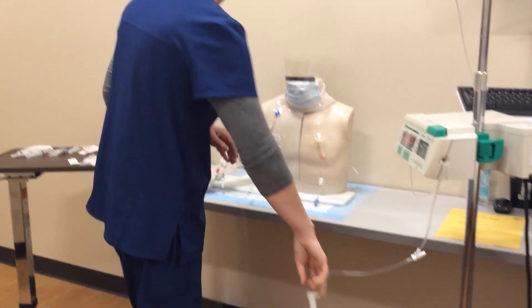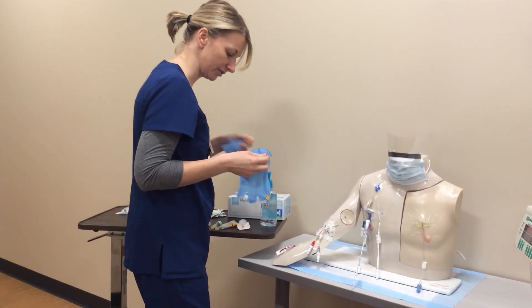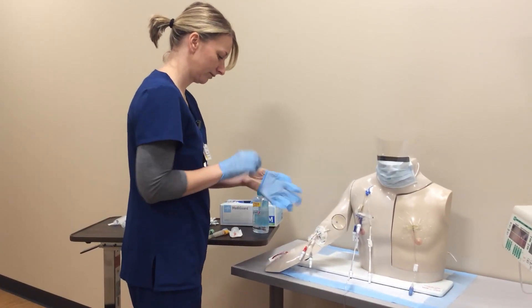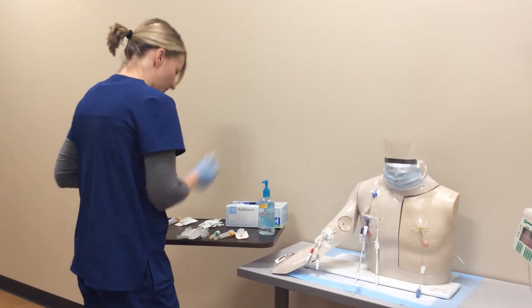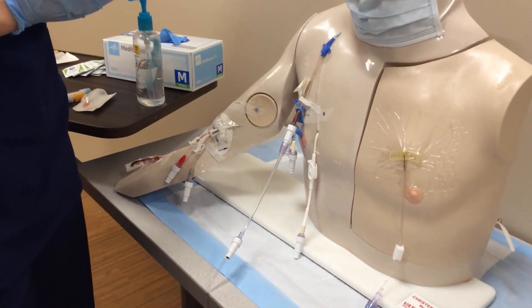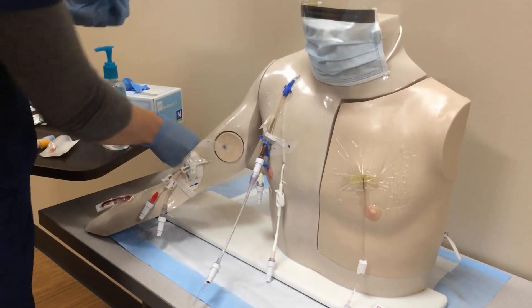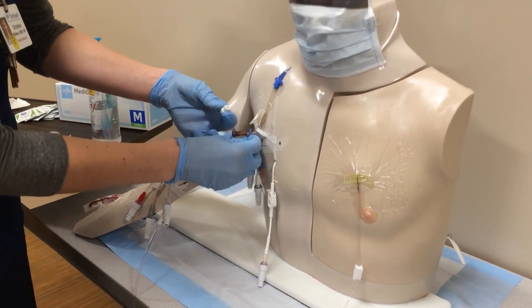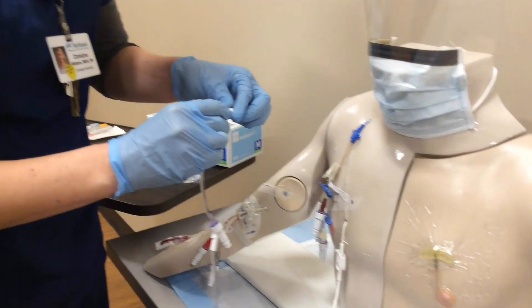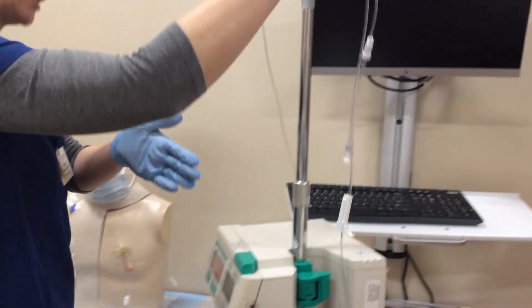I like to clamp mine as well. I'm going to put on a pair of gloves. Next I need to grab my sterile cap for my IV line. I'll open this up and have it ready. I'm going to make sure my central line is clamped, then disconnect and put a cap on my IV line. That's good to hang there because I've got a sterile cap on it.